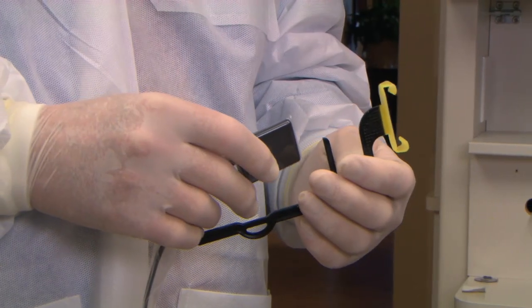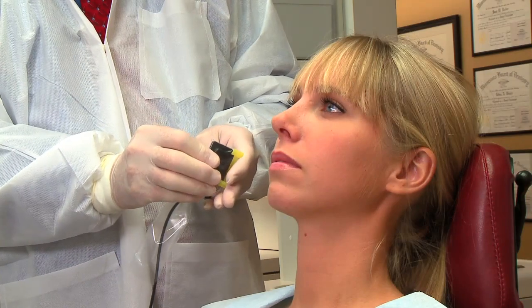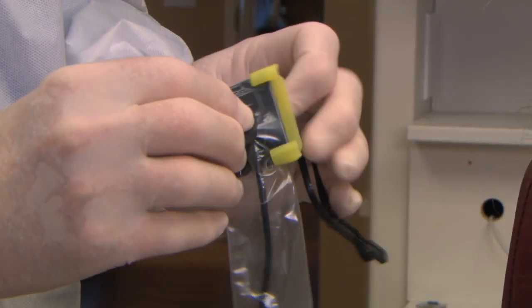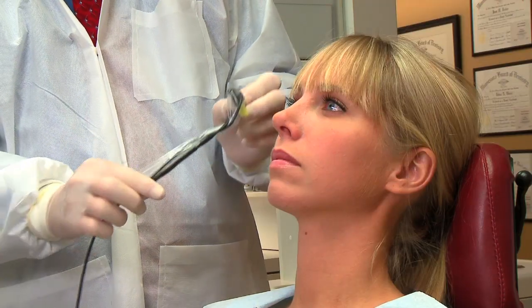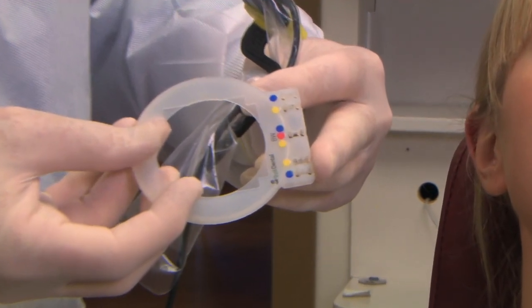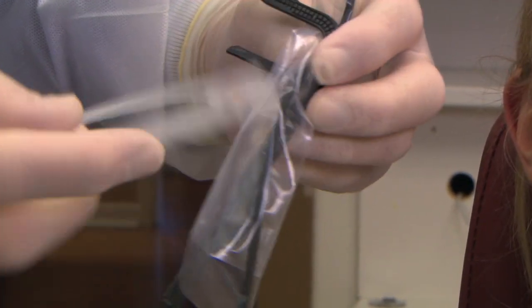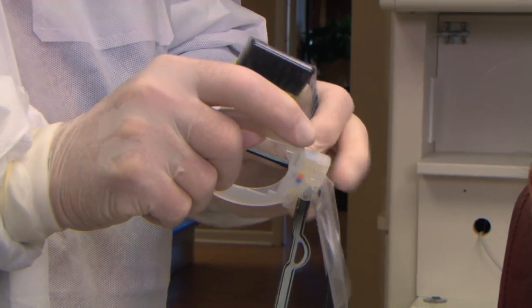For the posterior PAs, you use the TrollByte Kimera Yellow. Push the sensor halfway into the claw. That way, you use the full image area of the sensor. Keep the cable along the arm of the holder. On the aiming ring, the yellow dots indicate the positions for the posterior PAs, both upper and lower. Snap it in place and you're ready to take the maxillary PAs.